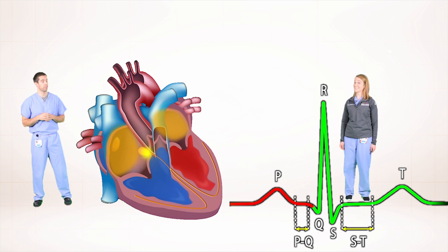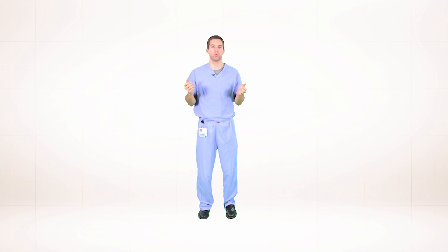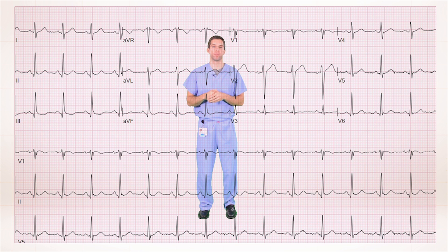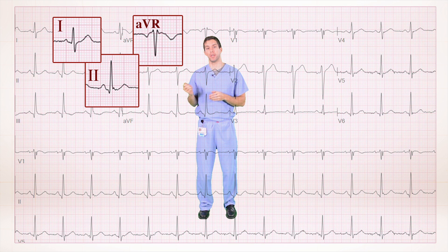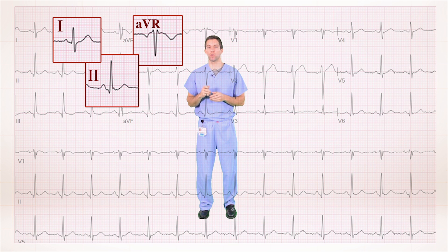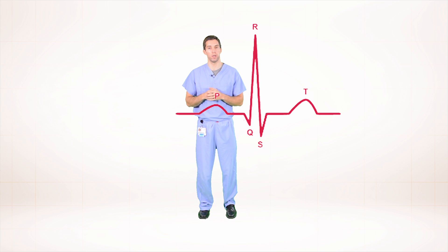Whoa, that was fast. Let's take a closer look at each wave. Here we have a 12-lead EKG. Where should we look at our P waves? Normal P waves should be upright in leads 1 and 2, and inverted in lead AVR. Let's take a closer look at lead 2 — a great lead to look at P wave morphology. Here we have a normal QRS complex with a normal P wave. Normal P waves should be smooth, monophasic, and less than 120 milliseconds.